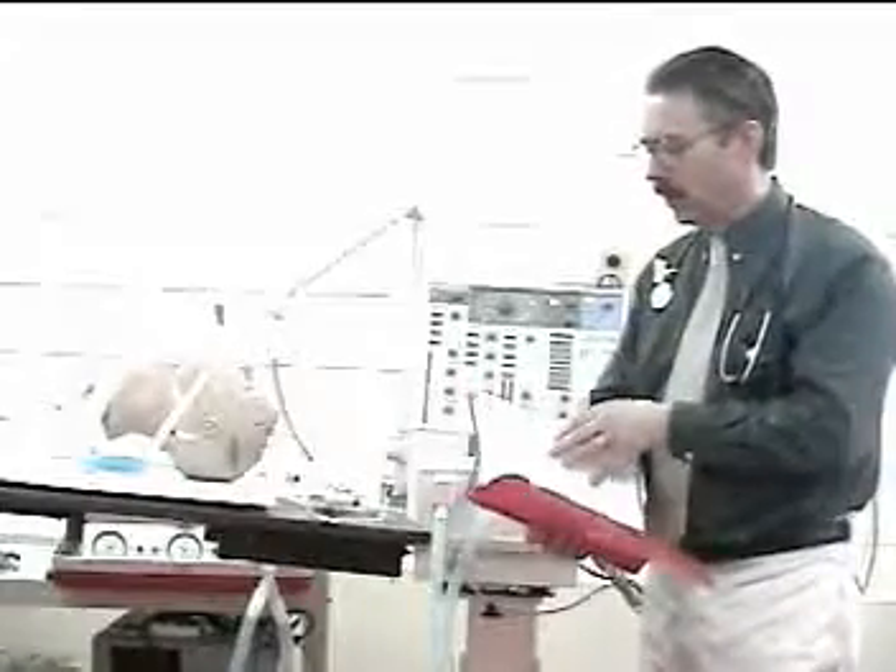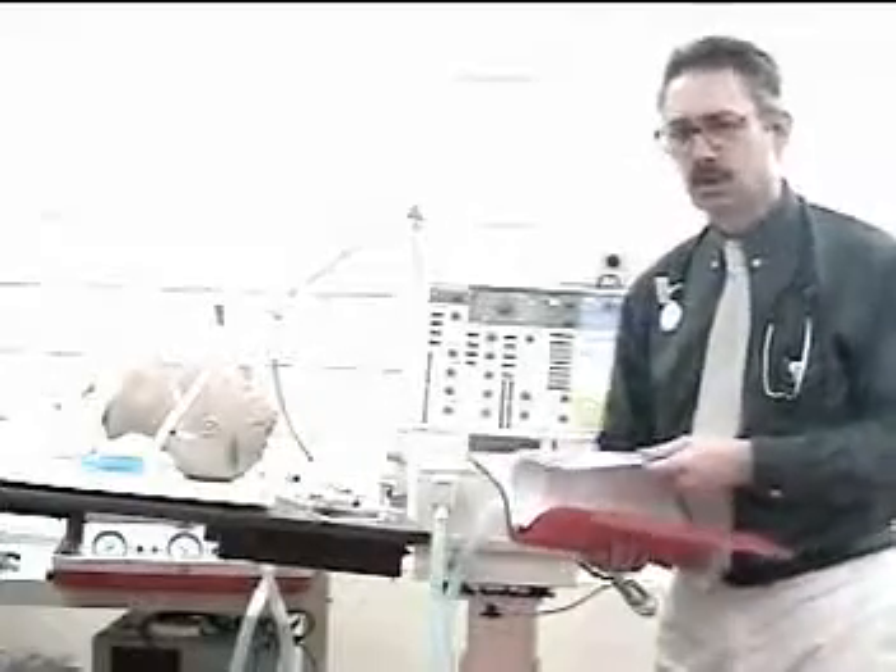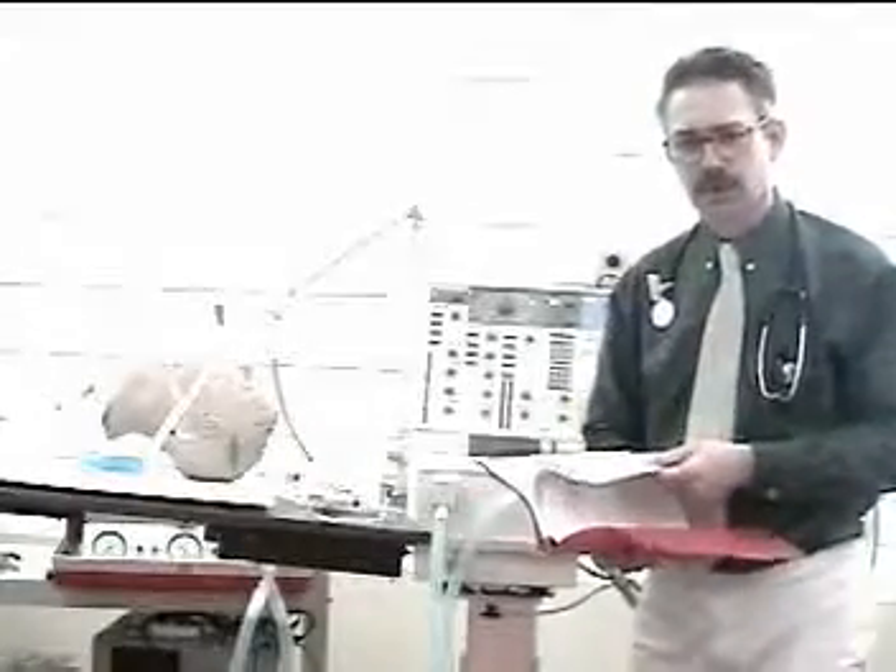You'll also want to review the patient's chart, looking at key information about why this patient is on the ventilator and how they are doing.